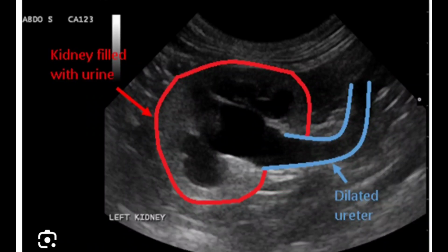To confirm a true pathological dilated ureter, you have to ask the patient to empty the bladder, and after 10 minutes just rescan, and if it persists it would be pathological, otherwise it would be just reflex.